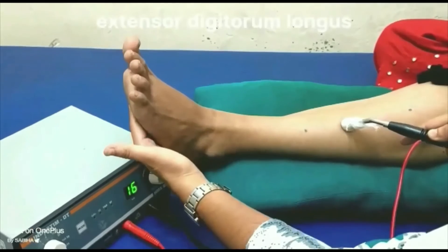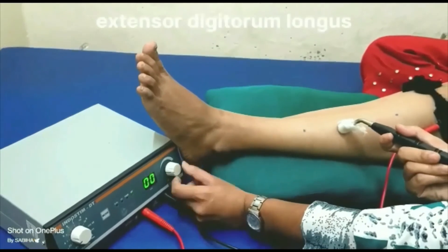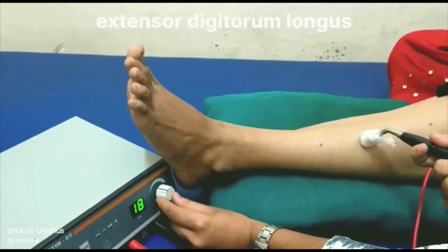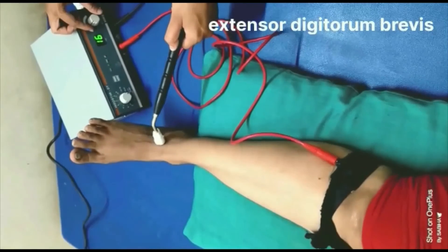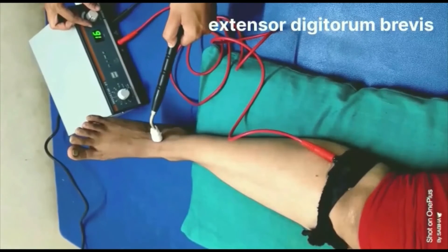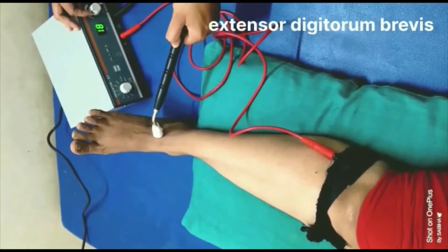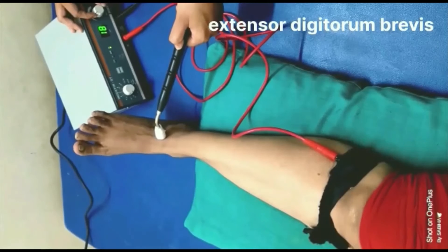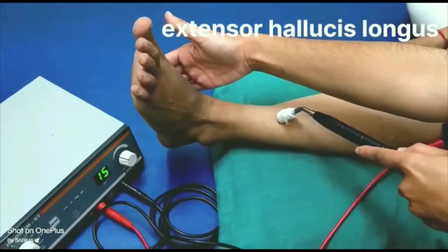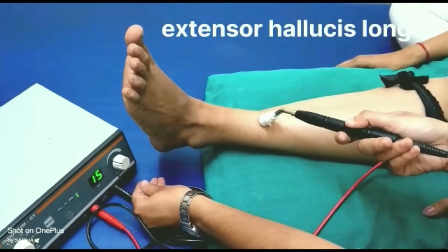For extensor digitorum longus: muscle response to IG is recorded, followed by muscle response to SF current. For extensor digitorum brevis: muscle response to IG is recorded, followed by muscle response to SF.